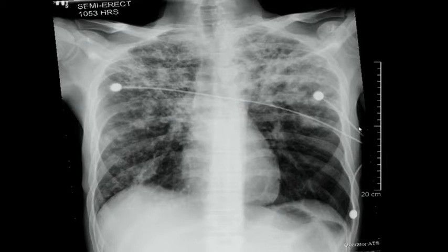patient, and I see here predominantly upper lobe reticular nodular patterns, some patchy opacities, I think some alveolar pattern. I think I see a cyst here as well. The heart is normal. I think there's some sparing of the left lower lung. It's mainly in the upper lobes. I don't see any volume change in the lungs. I don't know. Any other finding on the right diaphragm that you want to mention, because it's a unique finding? Hemidiaphragm.